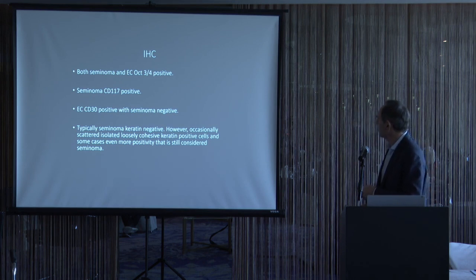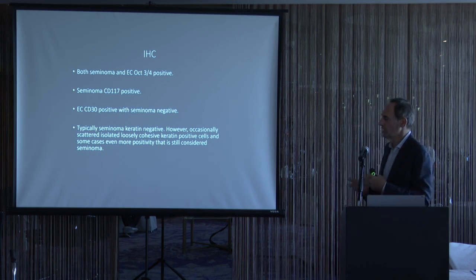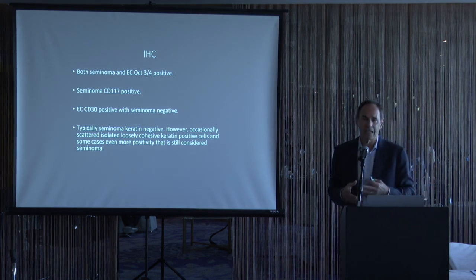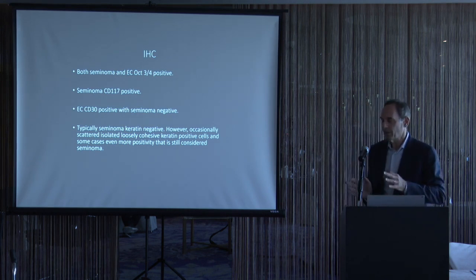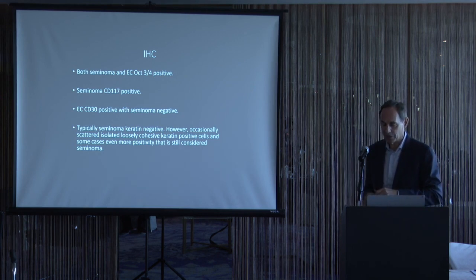The pitfall is that most pathologists think that seminomas are keratin negative. However, sometimes you can see loosely cohesive cells of seminoma that are keratin positive. And in some cases I've seen, there's actually been quite a lot of keratin positivity in still classic seminomas. So just be aware that although in general seminomas are keratin negative and embryonal carcinoma is keratin positive, that's not always the case, and some seminomas can express keratin.